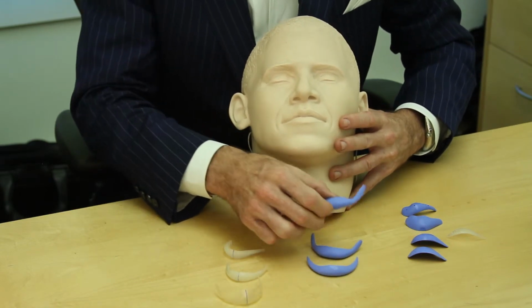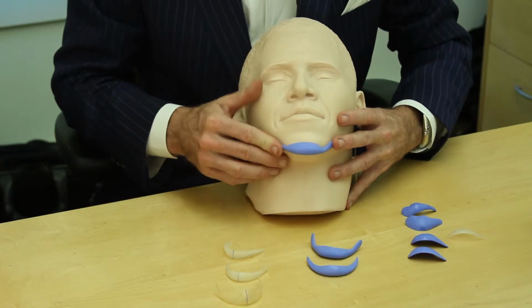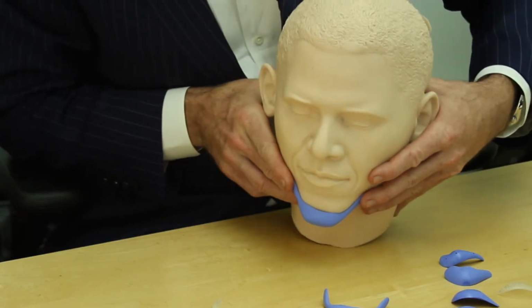You can see that there's thickness there. And in fact, some of these contours, and again, this is a sizer that I'm showing, can really bring the chin out. In the case of this one, a dramatic squaring of the chin would be achieved.